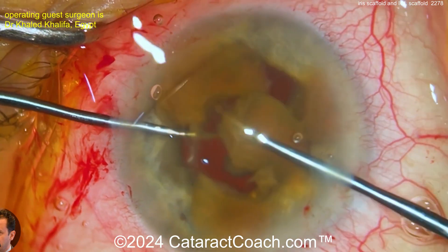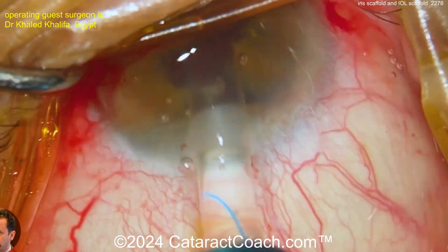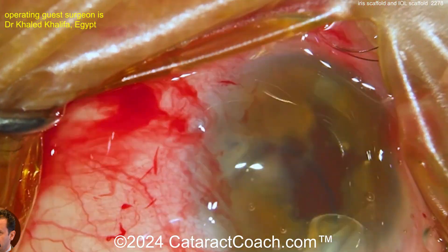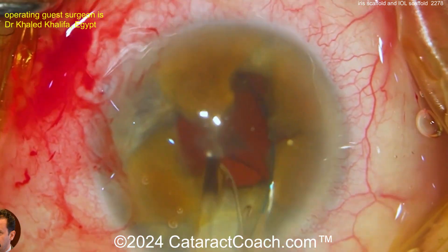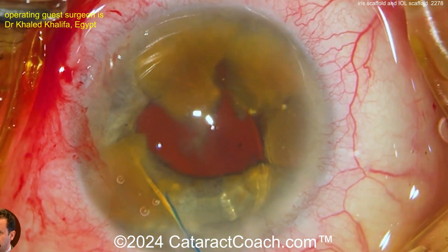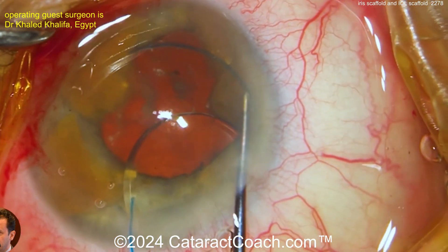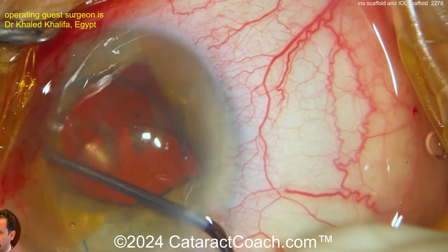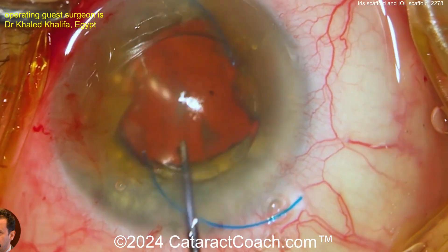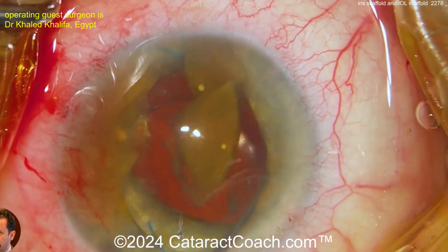Now you've got nice four quadrants — looks great. Push them to the side, create a little gap, and now get the lens in. You want the optic to sit on top of the iris — that's going to be your barrier effect, your scaffold. Leave that trailing haptic outside the eye; that's important so the IOL doesn't fall back into the vitreous cavity. Now with the iris and the IOL, that's a complete scaffold and it's totally protected.